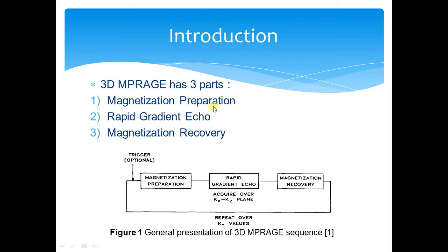However, in this study, I will evaluate T1 weighted images. T1 weighted MPRAGE sequences are frequently used, especially in fMRI, to obtain structural images. Other options for magnetization preparation are T2 weighted, chemical shift and magnetization transfer.